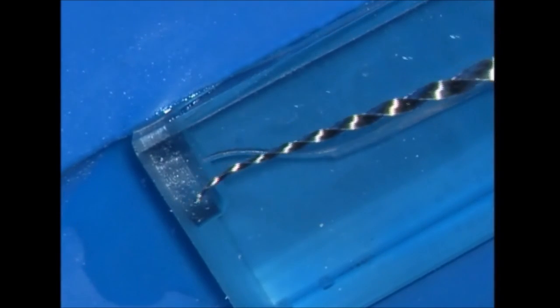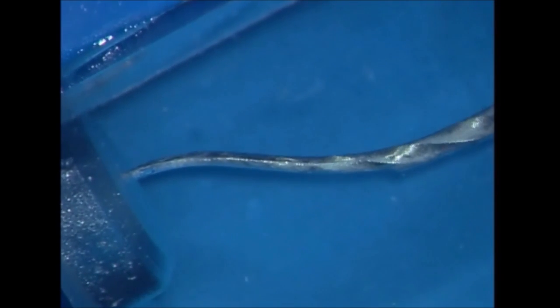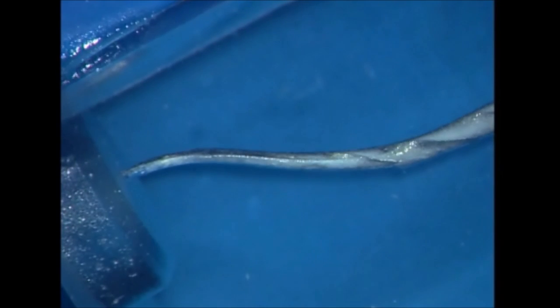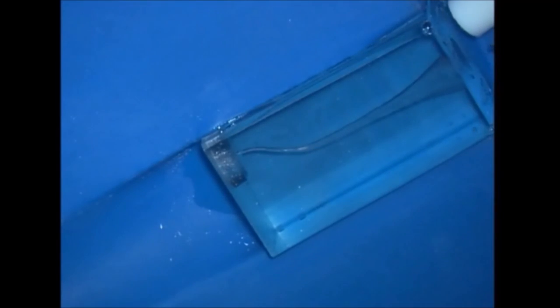To progressively manage the ledge, we use a ProTaper Shaping File 2. Again, the pre-curved instrument bypasses the ledge. Its greater diameter cutting blades refine and smooth and plane the walls and begin to reduce the ledge even further. This instrument is worked until it achieves length. After every greater tapered instrument, irrigate, recapitulate, and re-irrigate.